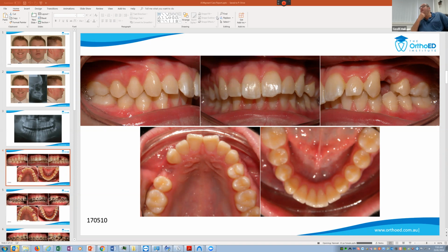You could have suggested maybe an asymmetrical mandibular advancement, because look where your lower midline is. Yeah. Is he still growing? He would be growing a little bit. Yeah, he's 14. So you could have done it with a Herbst appliance or any functional appliance but you're advancing the mandible a little bit more to the right hand side, which would also possibly have helped to distalize that molar a bit. A little bit, yep. Earlier on, would a functional appliance have been helpful? Probably. If you really want to maintain the midline, yeah.